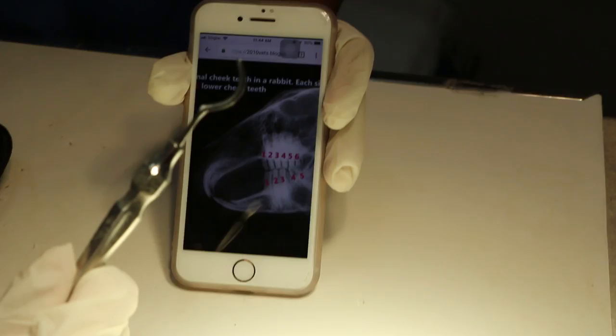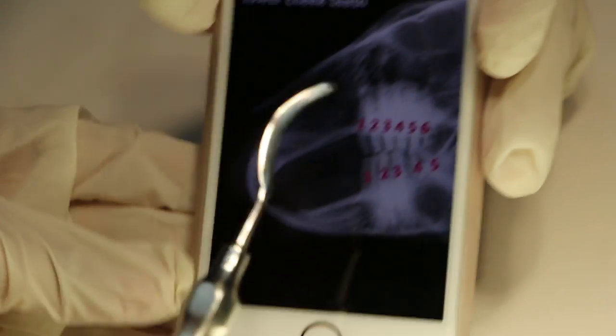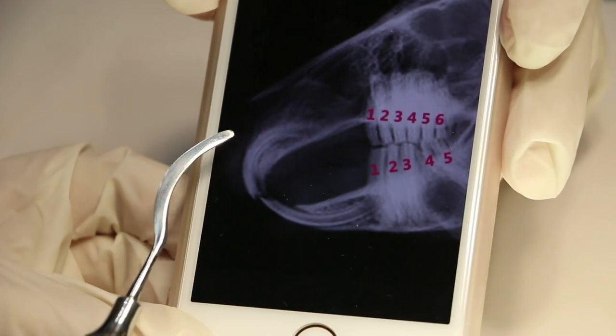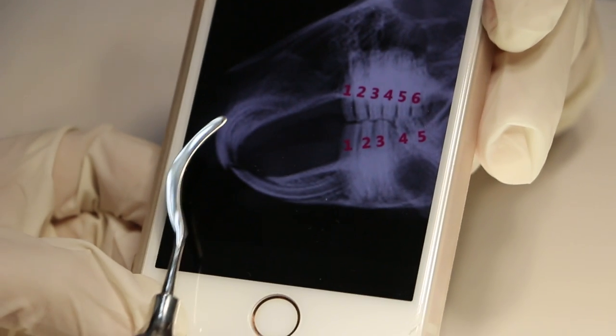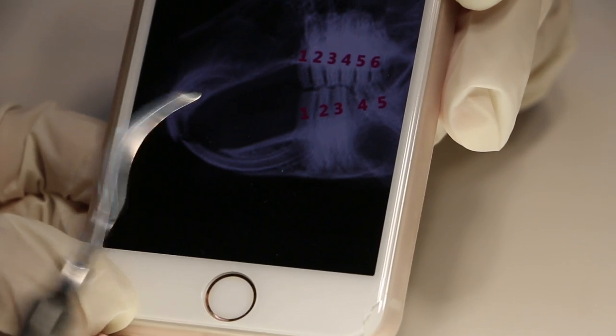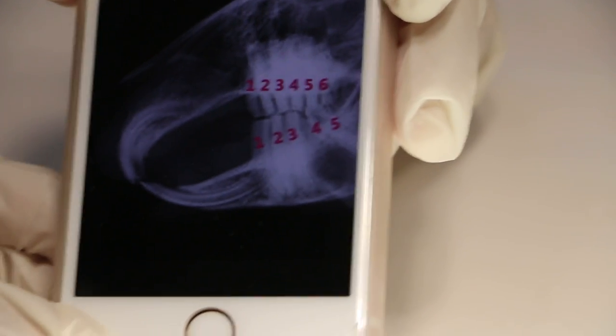This is the incisor luxator, which is used for loosening the ligament in between the tooth and the gums. We need to insert this and try it — for the upper incisor, go up to the root to loosen the ligament between the gum and the tooth.